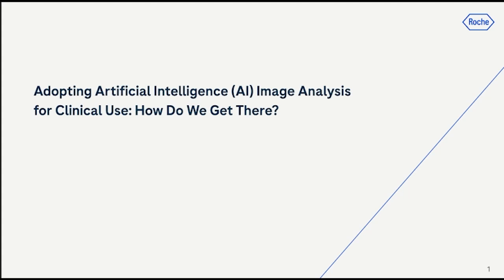First, one of the major red flags associated with AI is the potential for bias. So what data set do you use, and how do you train them? What rules do you use to build those algorithms? They're all very important. So CAP published one paper. It's like a white paper. We don't call it a guideline paper because guideline papers use a different process. This paper was published in Archives of Pathology and Laboratory Medicine in December 2023, specifically recommending performance evaluation for machine learning in pathology.